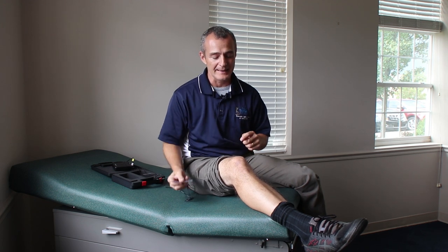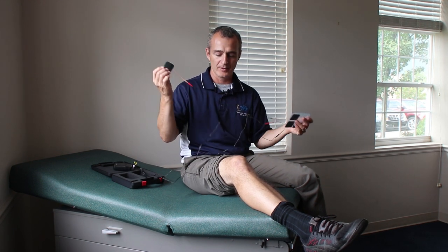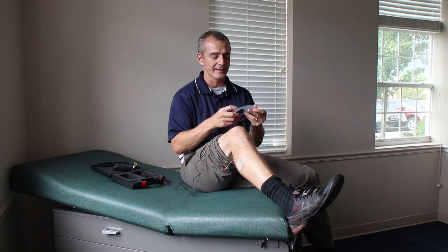You should always ask your doctor anyway. I'm going to show you where to place the pads. Assuming the incision is down the middle and the knee dressing and bandages are out of the way, the most typical way to apply your pads: using one wire on one side, I remove the electrode and place one electrode kind of low on the side of my calf muscle — not up at the bony part of the knee, but a little bit lower on the meaty part of the calf.